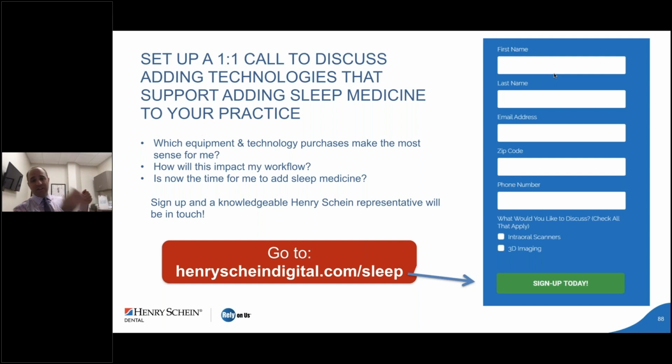And so I showed the patient, I put him up, and you really can't get a good view of a condyle on a 2D image. So I think it just gives you more information. I definitely, without a doubt, think case conversion is going to be higher in implants with a cone beam, where you can actually show a patient how to put the implant in, where it's going to go. You show them the precision and the guidance, and it solidifies the solution to the problem they have with a missing tooth. So I believe that case conversion is going to be higher.